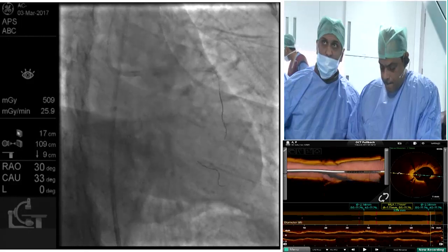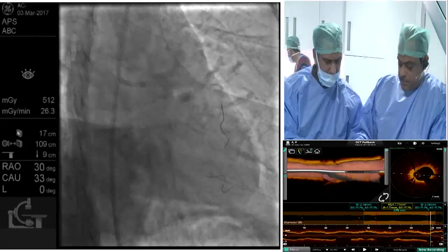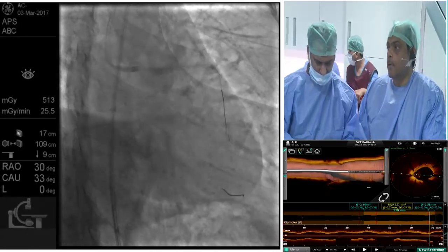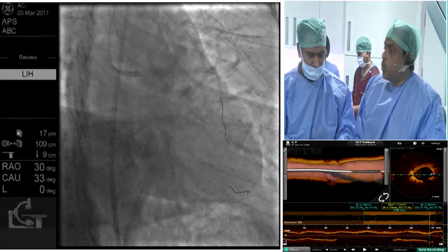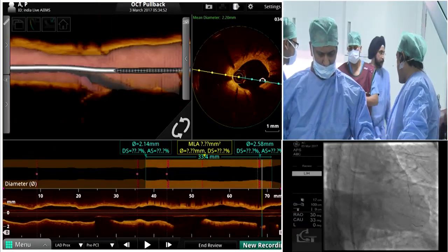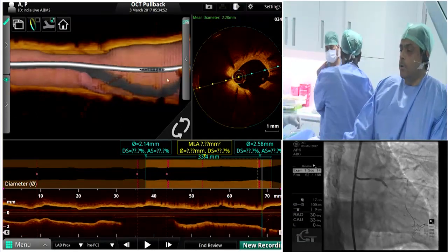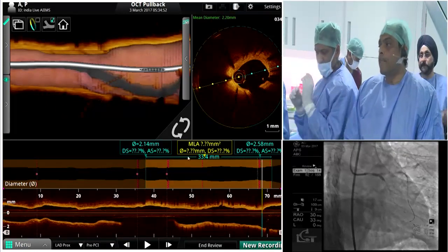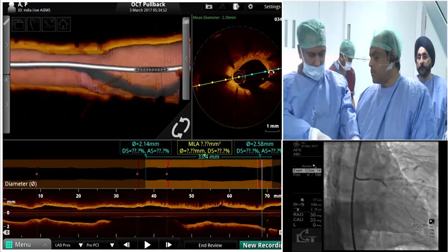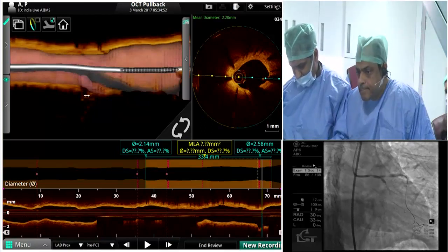Okay, here you have the circ. You can see the circ below. We'll try with the new balloon. You can see, with just a gentle rotation, the wire where it's crossing. You can see clearly. If they are showing the OCT images, just show the OCT image again. Image showing you clearly the wire going through the stent. Move a little bit. Turn the axis. No, the other side. Okay, stop. You can see the wire now at this point coming through.